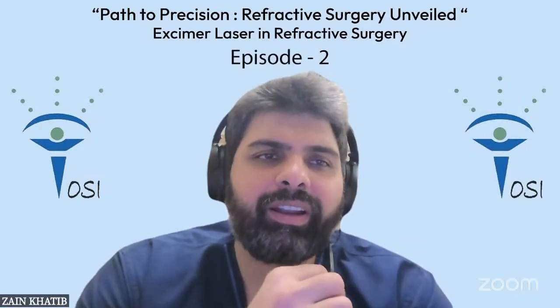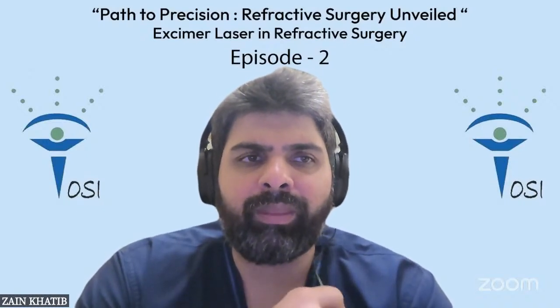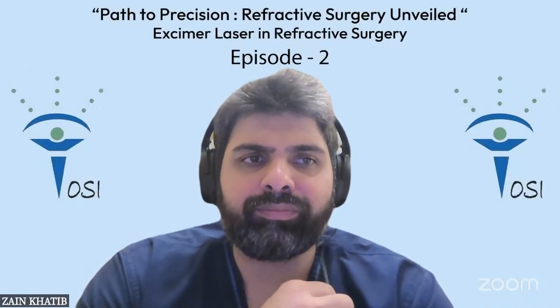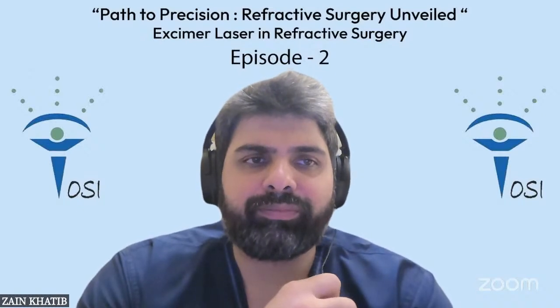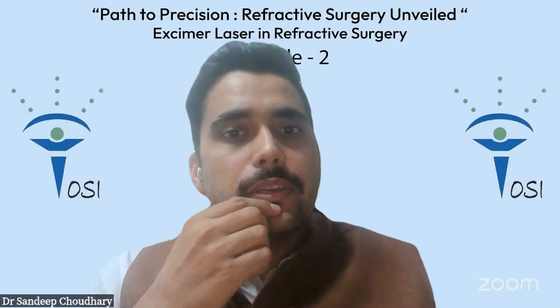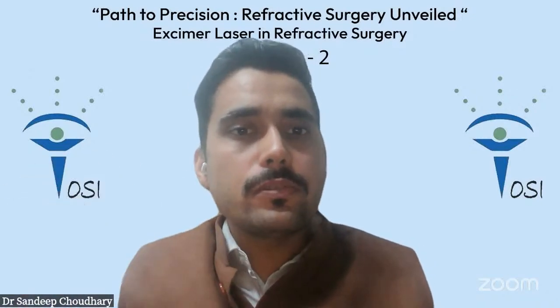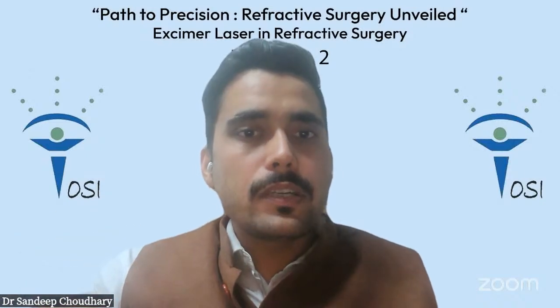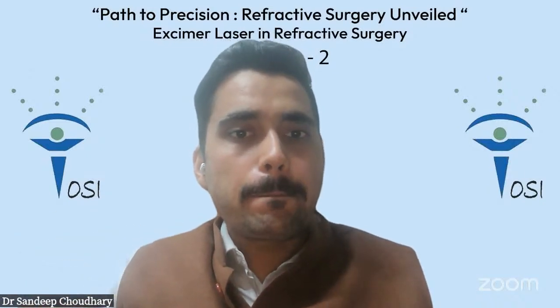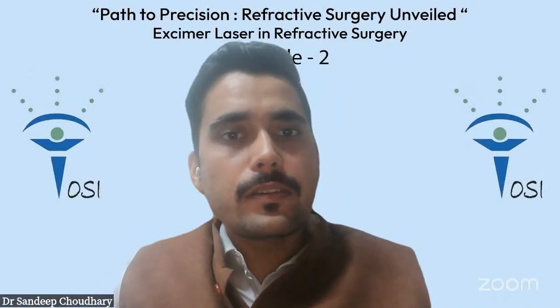Any specific indication where you would want to do Streamlight? So Streamlight, basically in the retreatment patient, we can go ahead with the Streamlight only because we don't want to expose the flap. So your choice would be manual removal, and Streamlight for retreatment. Yeah. Okay, then let's move ahead to the next talk now.